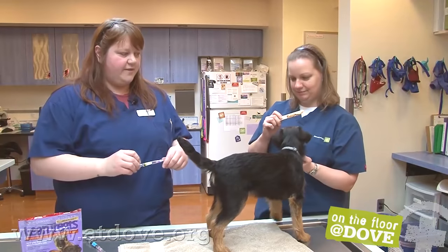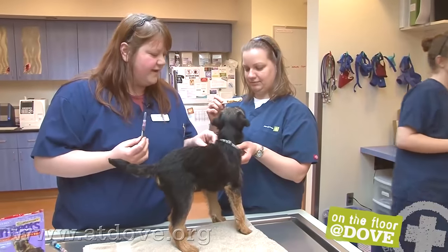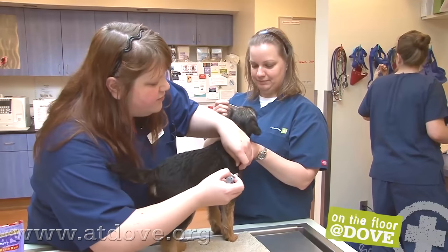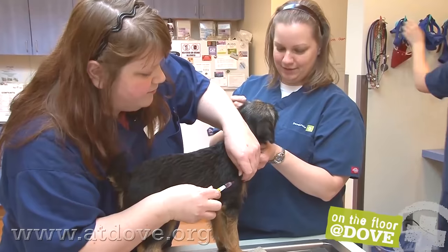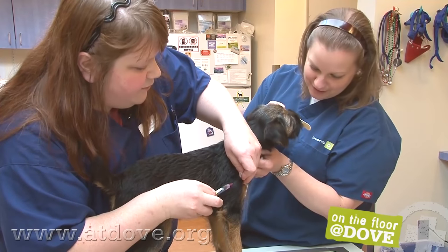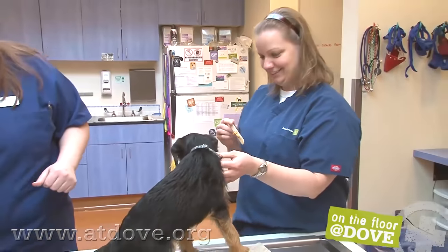We'll start with the DAP. We're going to go on this side, just a little bit lower than his shoulder. We're drawing back and injecting — and this is not the one that stings. Good job. And that is it for that one.